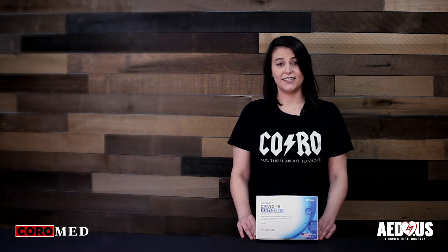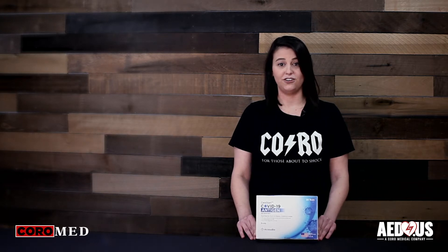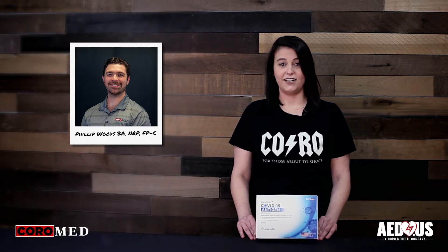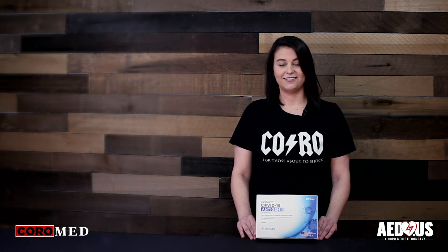It is important that this test is performed correctly and by a medical professional. So we have Phillip Woods, our account manager and resident in-flight paramedic here today to administer the test for me. So let's get started.